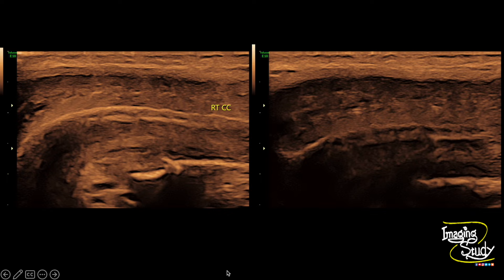Here is the long section of the right and left corpora cavernosa showing normal echotexture with no definite hematoma or any other abnormality.